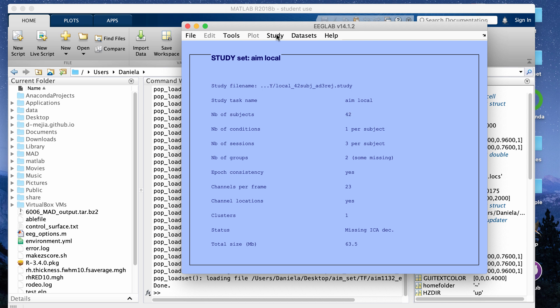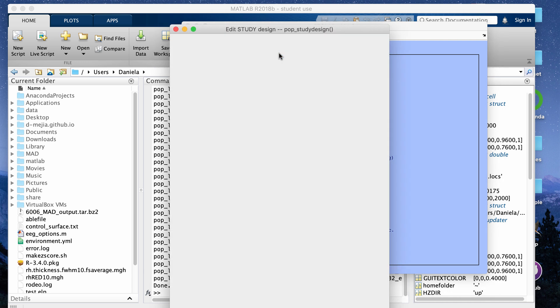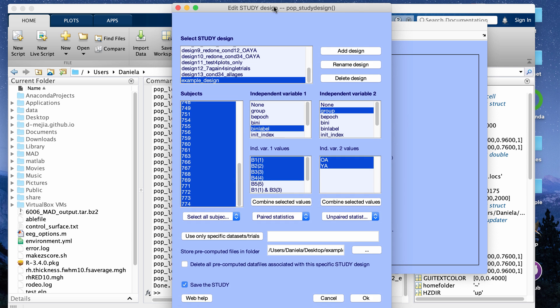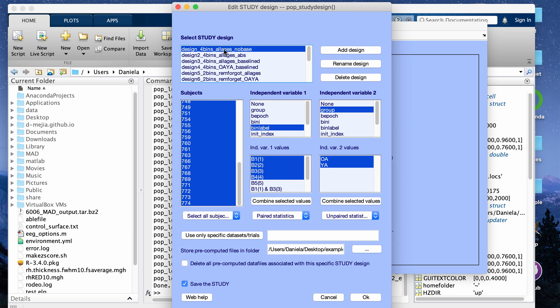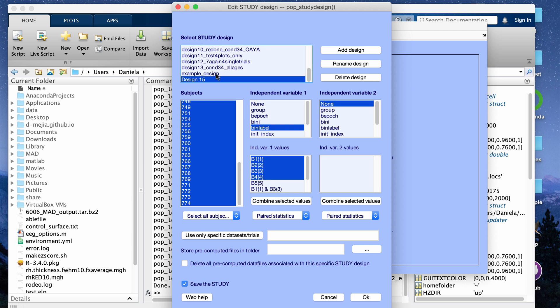Now let's go into the actual tutorial of how you create time frequency plots. I'm going to go up to the menu bar and click Study. The first thing I'm going to do is create a study design. This is the design that tells EEGLAB what type of analysis and what conditions I want to include. I've already created multiple designs, and to create a new one you click 'Add Design', which creates a new design at the bottom of the list.